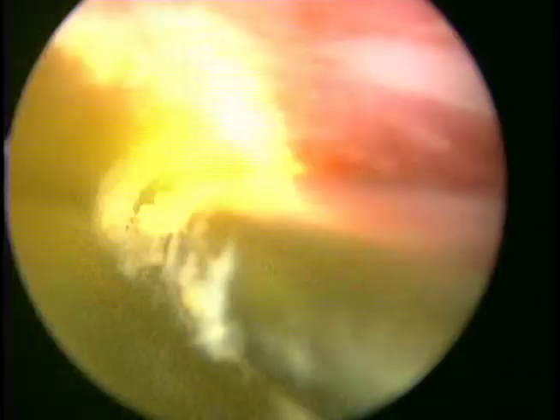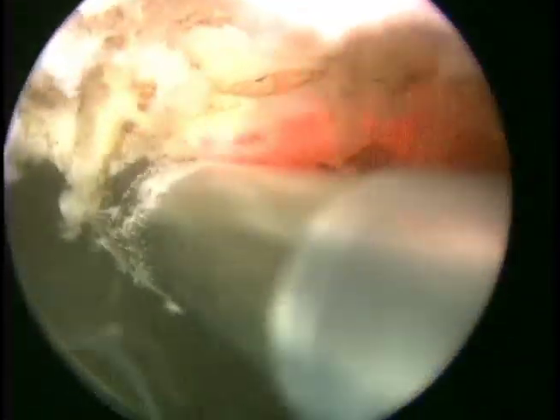Well, now treating more the left lobe, we encounter small submucosal bleeders, which we'll just take the time to treat with a combination of both coagulation as well as vaporization in order to maintain great tissue visualization.